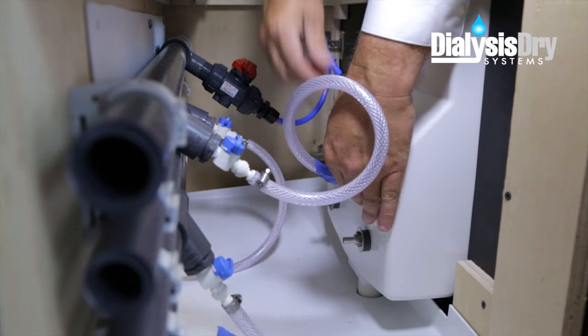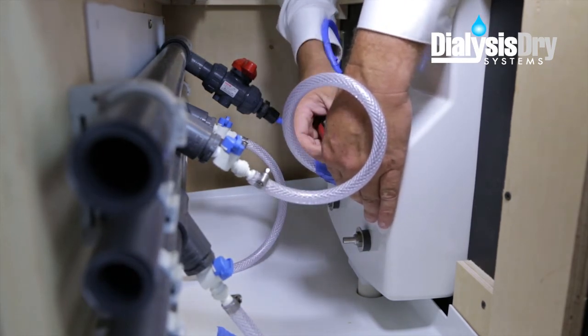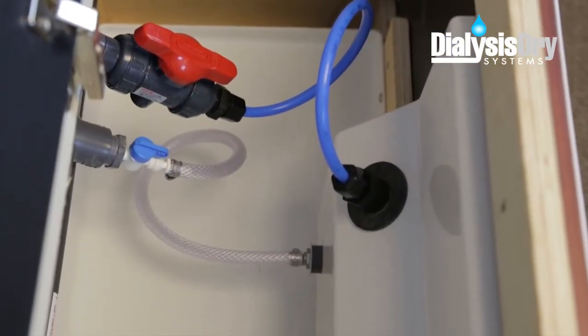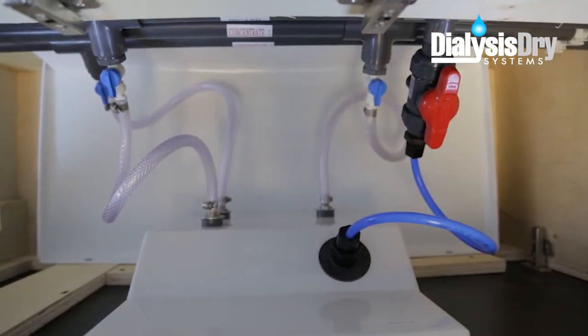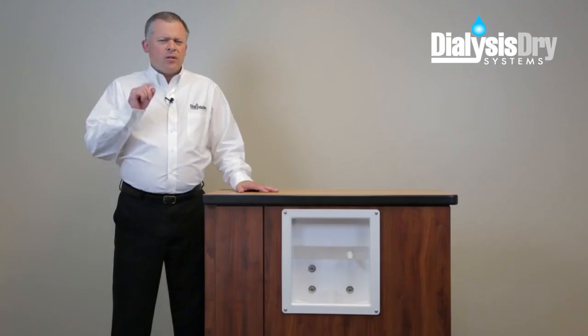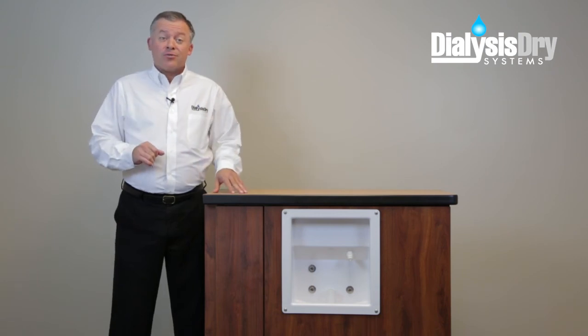The final step is reconnecting all tubing to the correct ports on the back side of the dialysis supply and waste box. It's always a good idea to follow the labels and make sure each of the lines are connected to the right port. Now that all the lines are properly connected, you can see how the DDS interceptor tray extends across the interior, creating a safeguard under all connections that could cause a potential leak. One note to keep in mind: after completing an installation, it may be necessary to disinfect the dialysis plumbing lines before continuing any patient treatments.